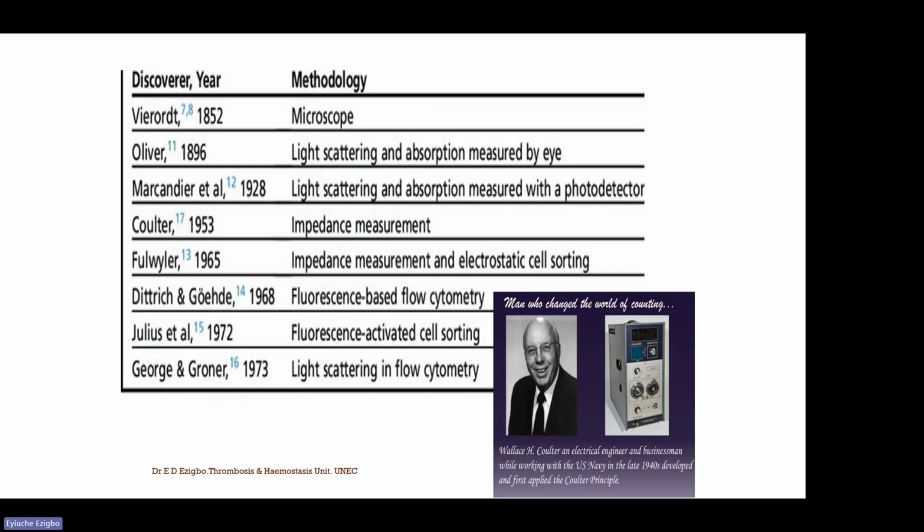The development of the automated hematology analyzer follows the discovery of microscopy in 1852. These are the historical landmarks in the development of automated hematology analyzers.